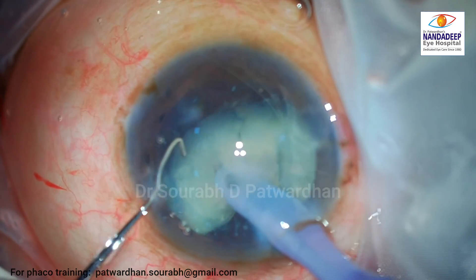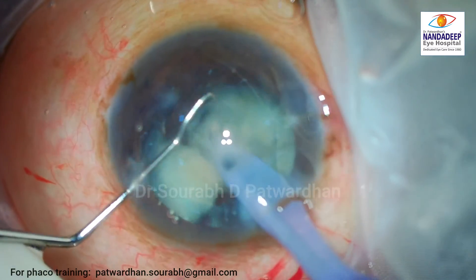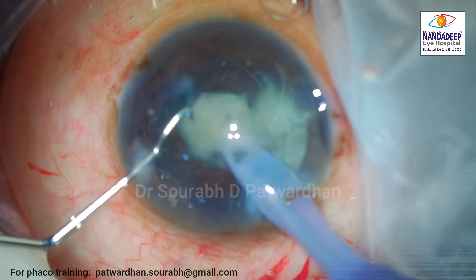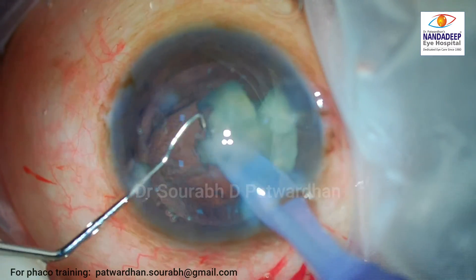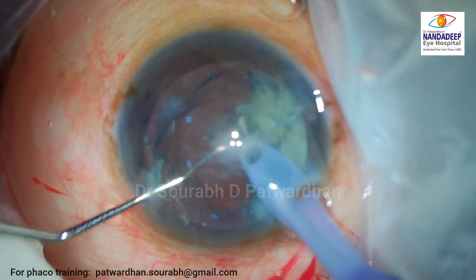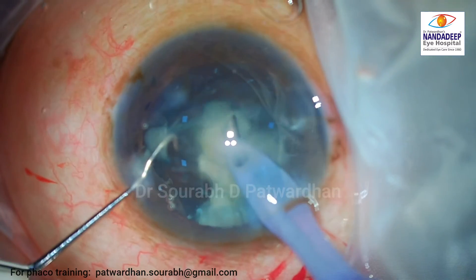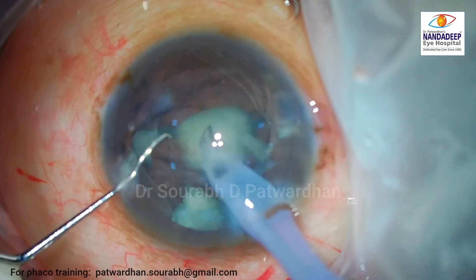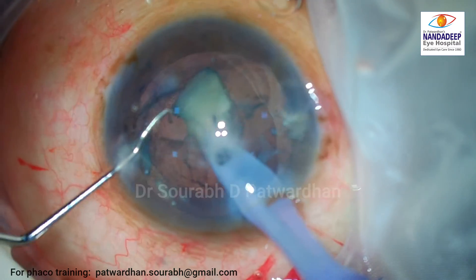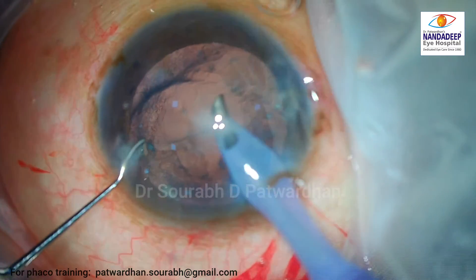You can either order the instrument or ask an instrument manufacturer to create it, or as I showed, just order a one-millimeter Sinskey hook and bend it as per your need. Once the nucleus is divided — it's not a very hard nucleus — you can just keep the phaco tip at the center, press the foot switch, and the nuclear pieces will vanish one by one.